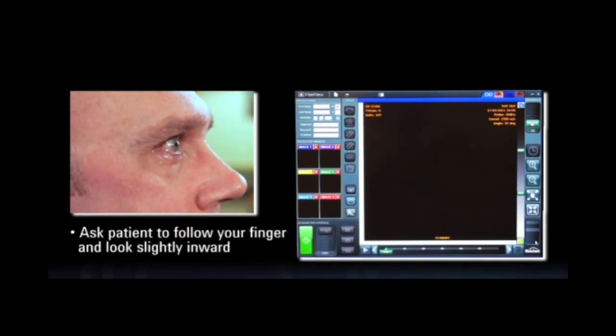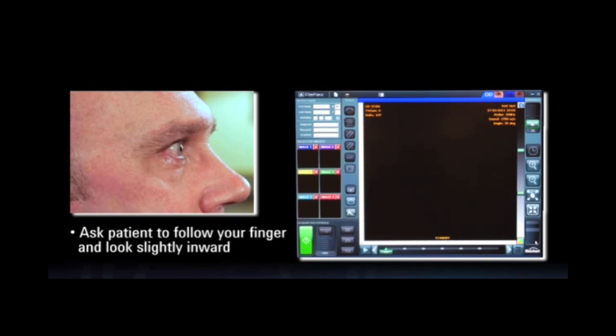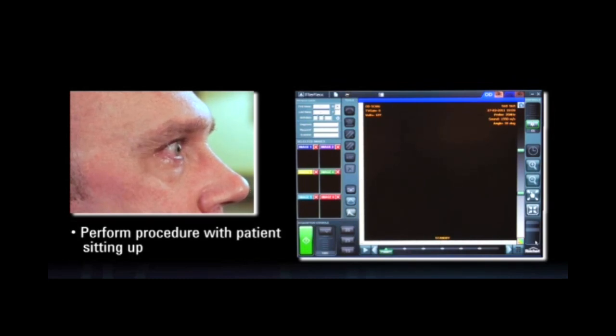Okay, subsequent to the numbing drop, we're going to do an examination of the temporal angle right here. It's important. Look straight. I want you to follow my finger. If I'm looking at the temporal angle, I'm going to have the patient look slightly inward, like this. Look through my finger and find a spot on the wall. You'll notice I'm doing this examination with the patient sitting up. This is the same orientation as the ophthalmologist or optometrist might have when they're examining a patient. Therefore, the subsequent UBM images that are captured are going to correlate more highly than if the patient were laying down. Look through my finger and find a spot.